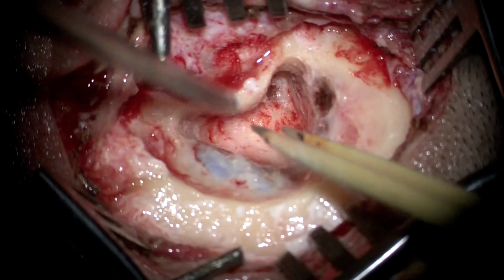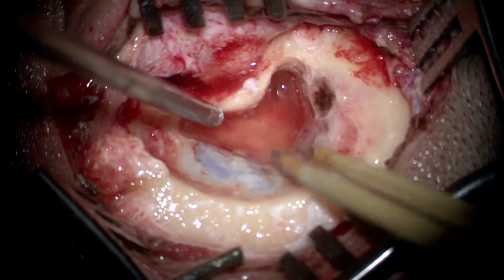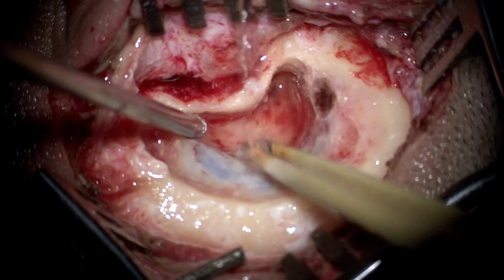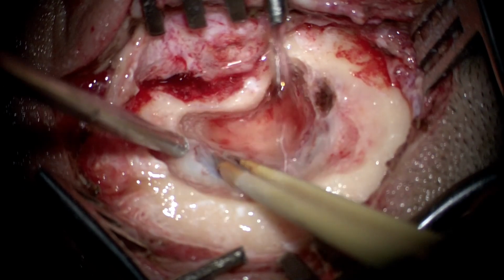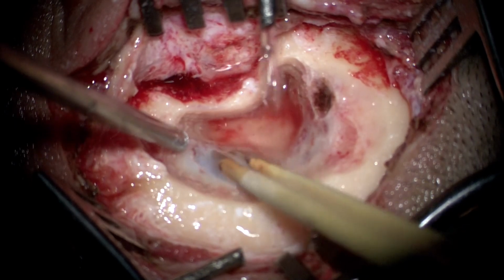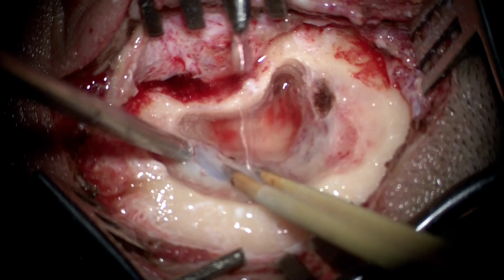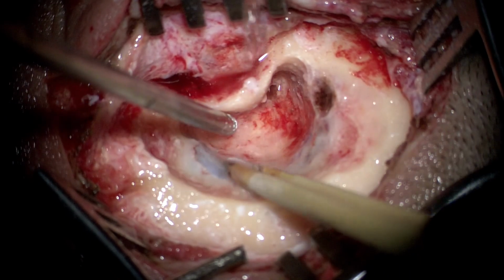Now we can see how the sinodural angle is completely exposed from posterior to superior, and the dural plate has been literally thinned out, and the angle completely open. This is in contrast to how we began in the sclerosed mastoid, and goes on to show that the amount of exposure required laterally to commence medial drilling is very important.